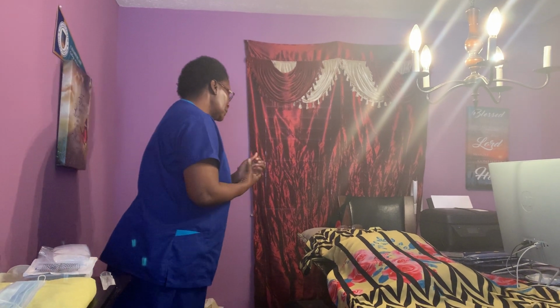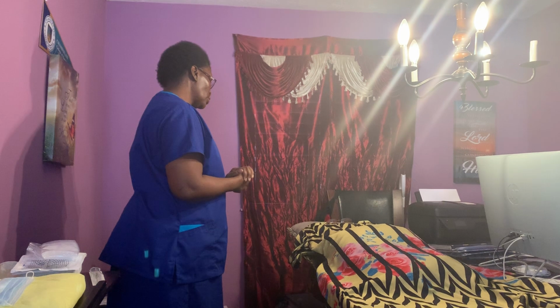I am now in the patient's room. Knock, knock. Hi, hand hygiene. Good morning. My name is Annie. This morning I will be performing a wound dressing. I'll be changing your dressing this morning.